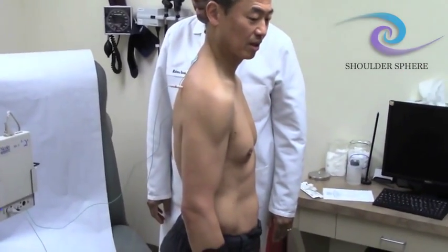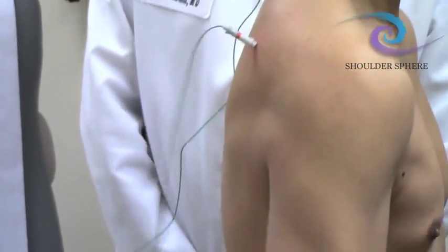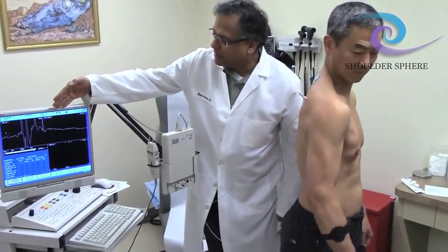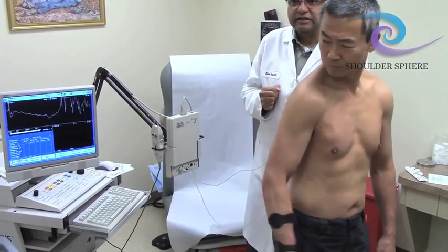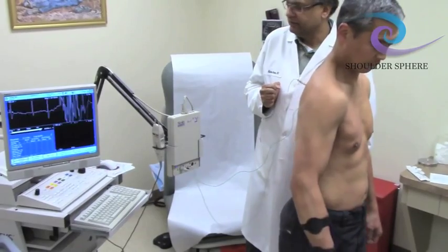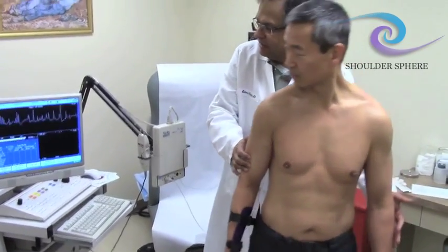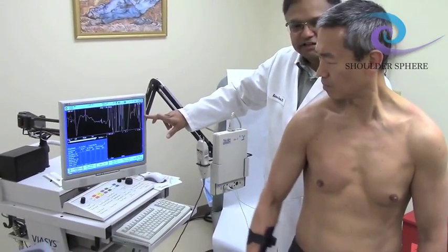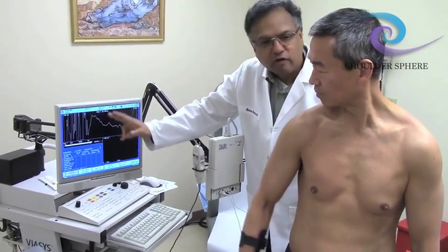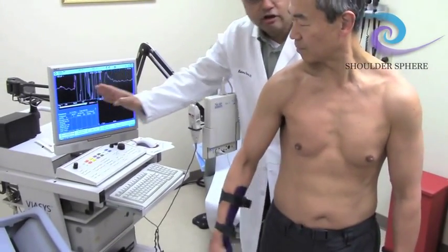This is a totally at-rest, neutral position. Now I'm going to start the shoulder sphere. You can see a distinct pattern of firing. This muscle is firing at a rate of about six to seven hertz — six to seven times a second. On a time base of 100 milliseconds: if you fire so the wave stays right here, you're firing at 10 hertz; if it comes here, you're at 12 hertz; and as it goes there, you're at about six or seven hertz.